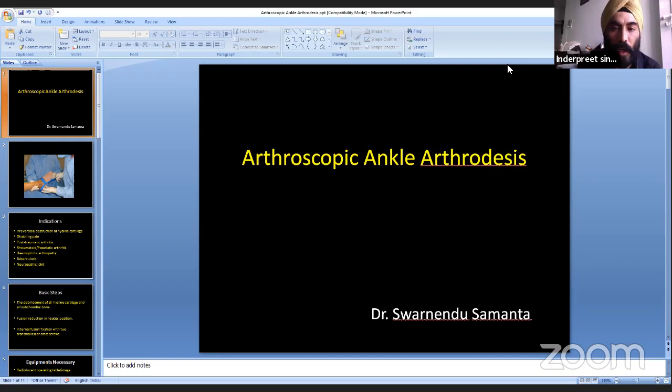One question is, if you have a dome collapse secondary to avascular necrosis of the dome of talus, which is quite common seen in traumatic lesions, would you still go ahead and do the same procedure which you are doing, or you would do an open ankle arthrodesis with grafting?